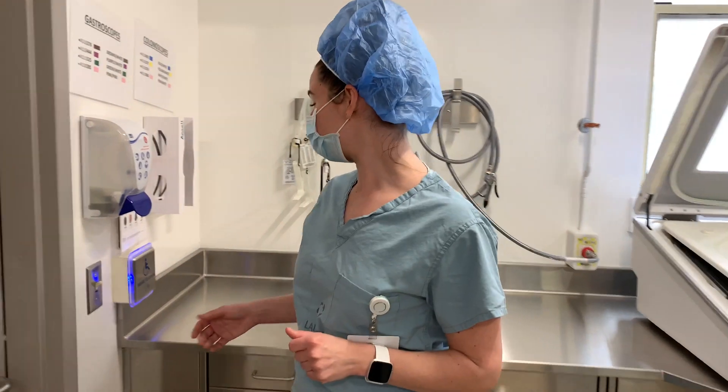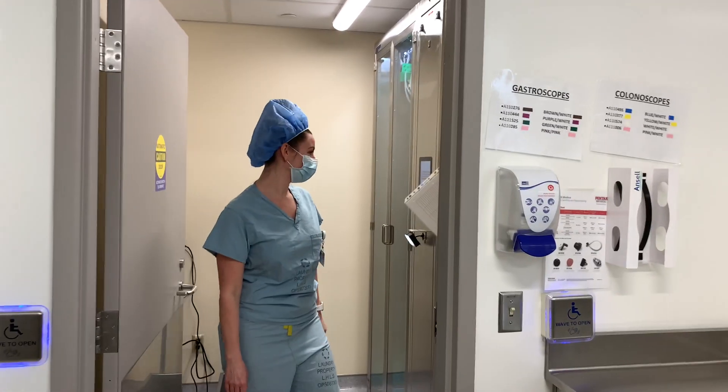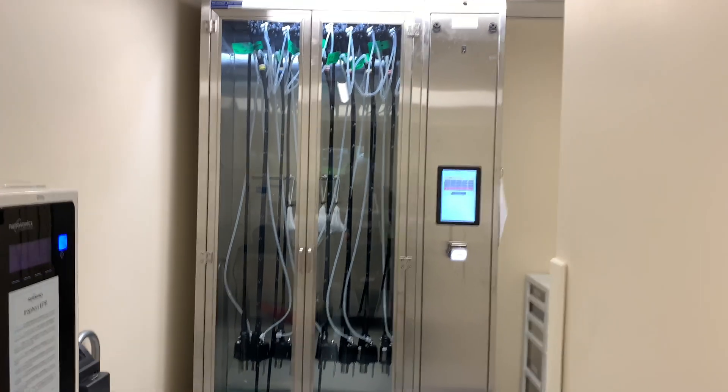And then we move on to our clean storage area. Once the scope is reprocessed, it moves along into this room and it's hung in our endocabinet storage area.